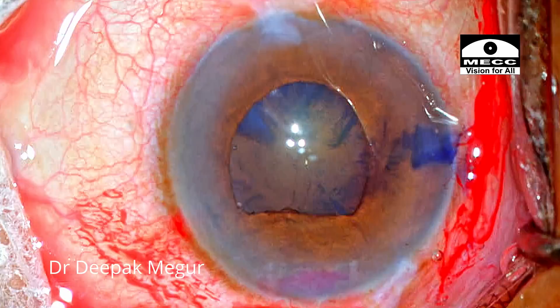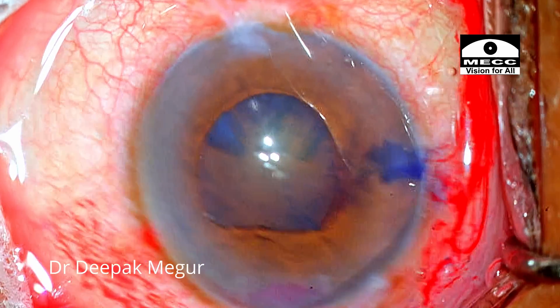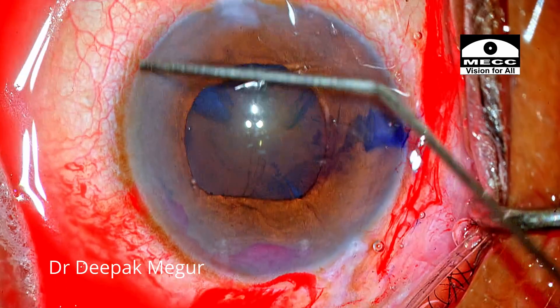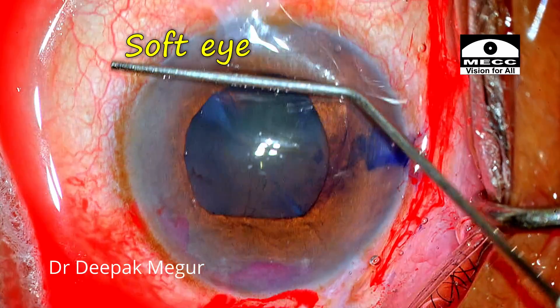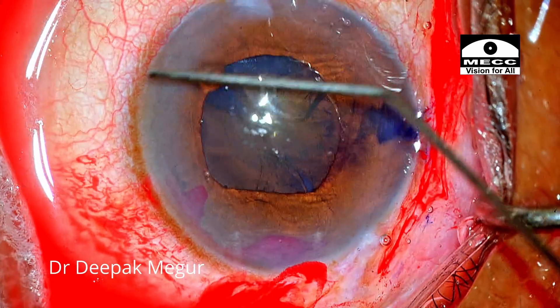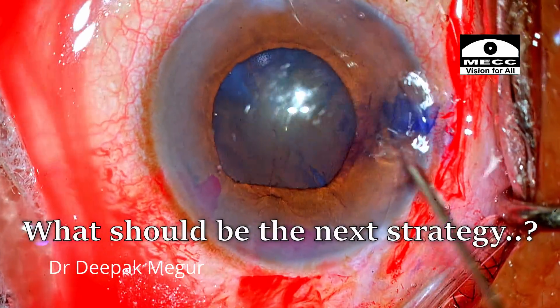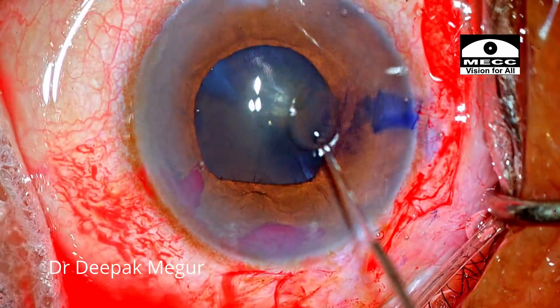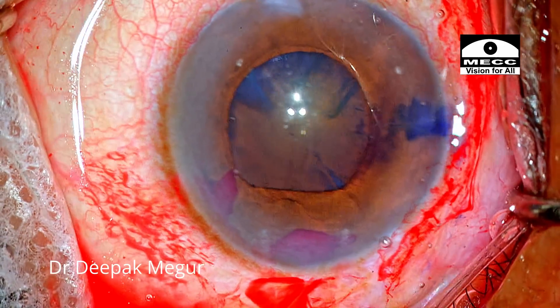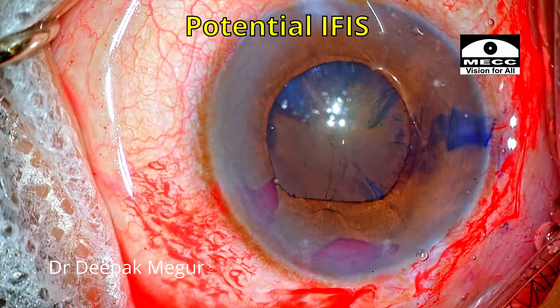At this point I'm really worried whether this case is going to behave just like an IFIS eye and cause a problem. I check the pressure — it's not a hard eye, it's a soft eye. So maybe the iris itself is misbehaving. My mind is now deciding on strategy: I don't know whether I'll have more problems as I proceed. I decide to go in with my B-hex ring and treat this case as I would treat an IFIS case.